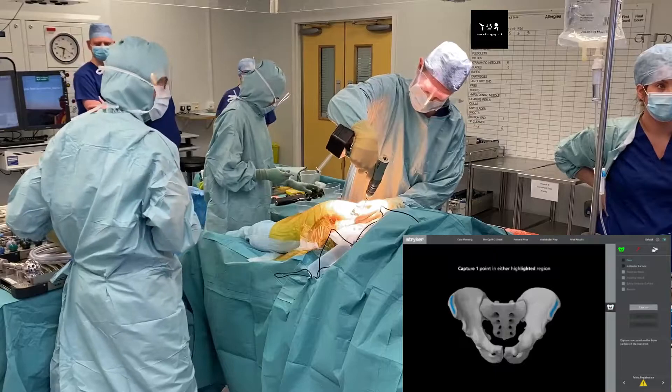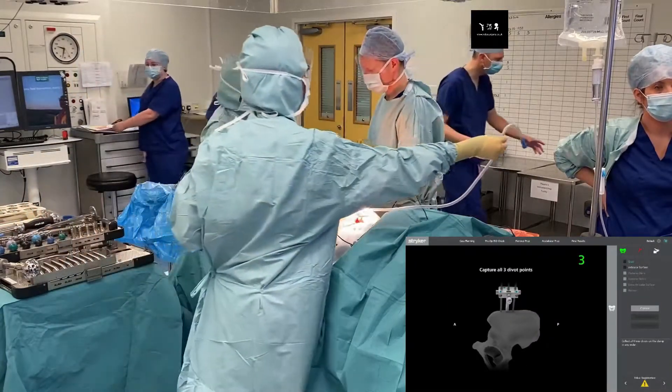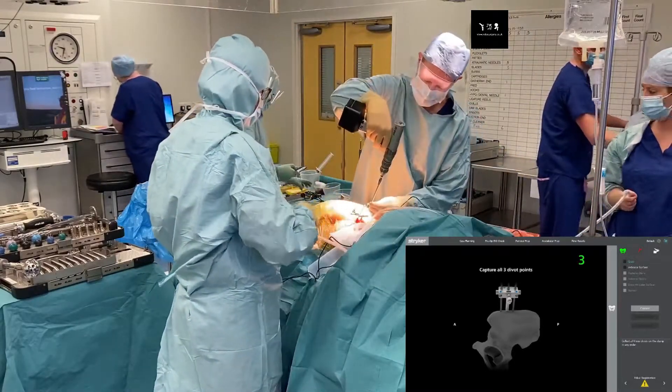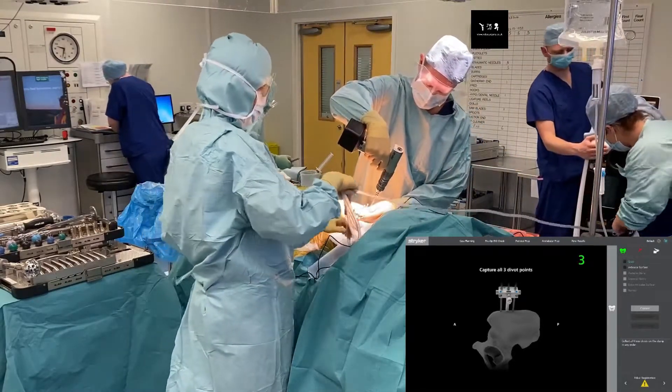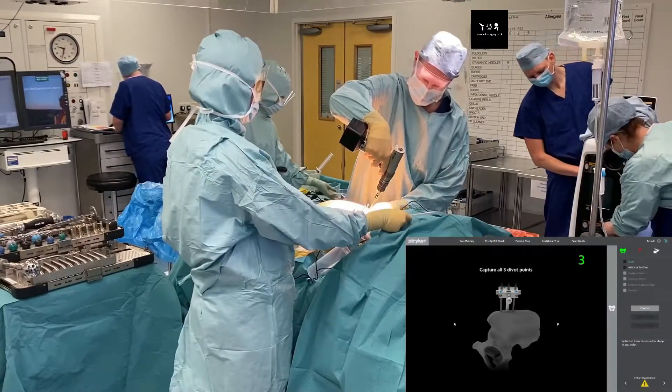Then we add in two more drill pins for stability. It's similar to putting on a pelvic ex-fix, and after a bit of practice you can place these pins very quickly and accurately.